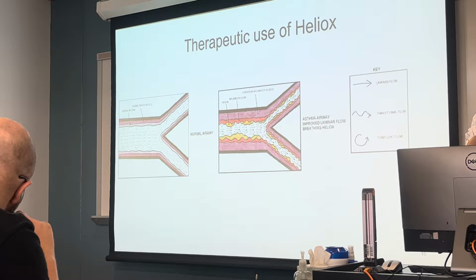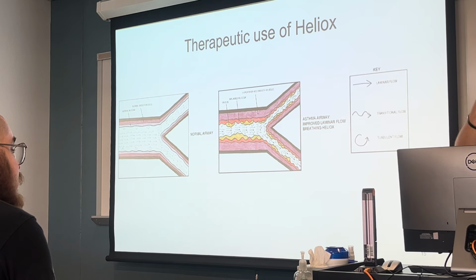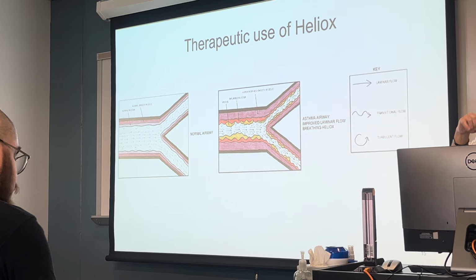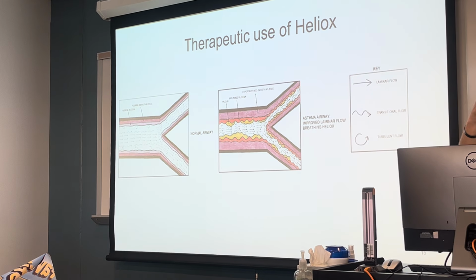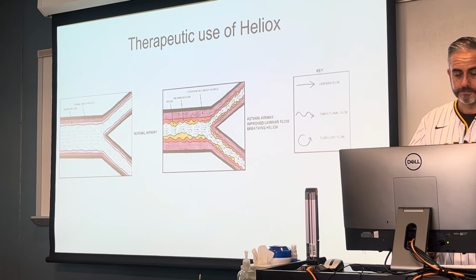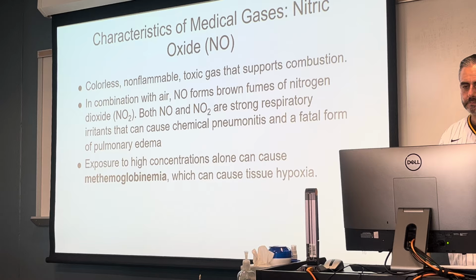The bronchospasm is not reversing, it's not breaking. I've even switched to the continuous bronchodilator. I've been giving this bronchodilator for 8 hours straight. Everything's still constricted. What happens if their O2 sats are beginning to fall, beginning to dip? I can try heliox. Heliox can power the nebulizer. It can power their non-rebreather, their oxygen device, to try to get, again, oxygen down to the alveoli. All right, so that's heliox. Again, heliox is a mixture of helium and oxygen.